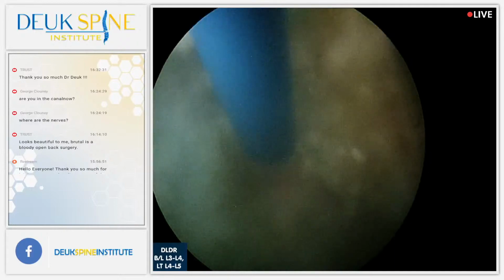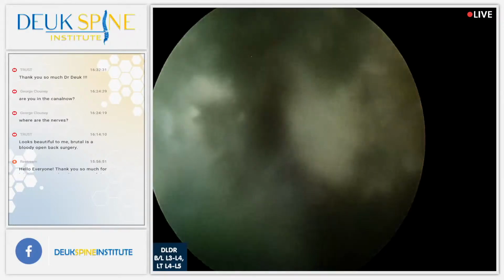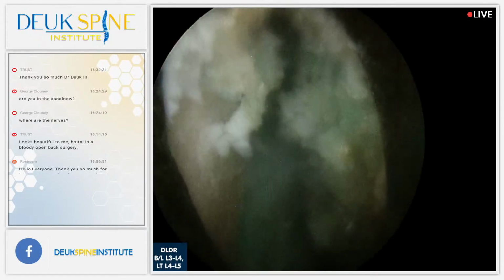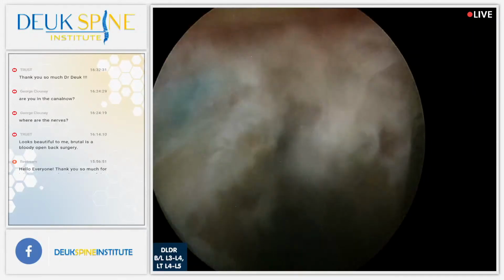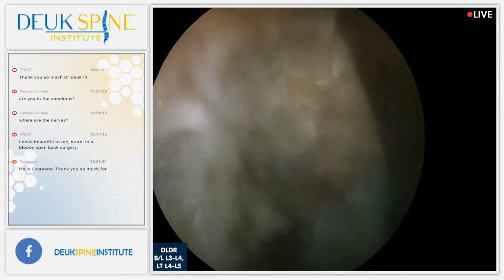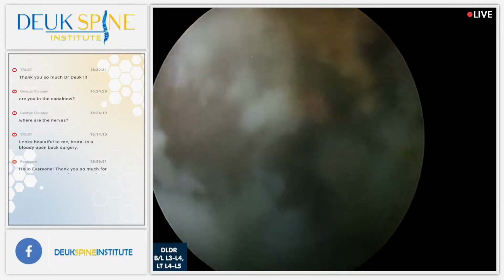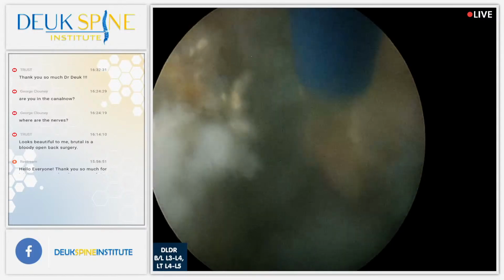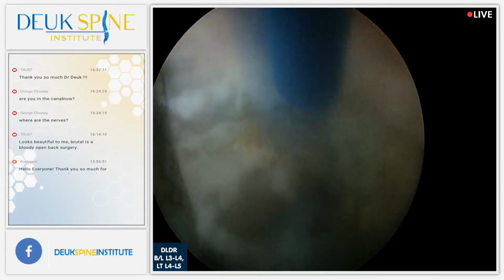Boy, look at all that calcium. More herniation. There it is, 5 minutes. Let's do passing 2x2 and prime 4, please.